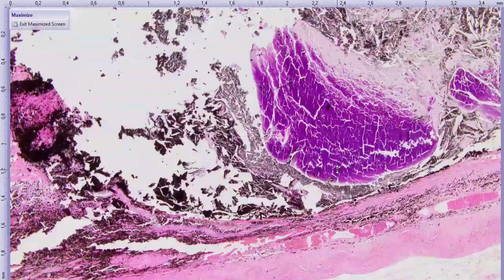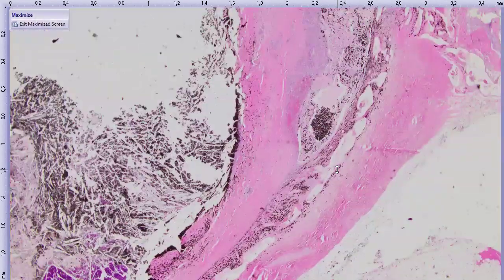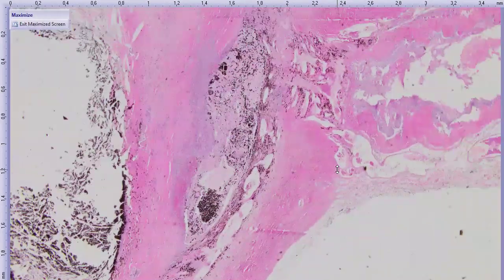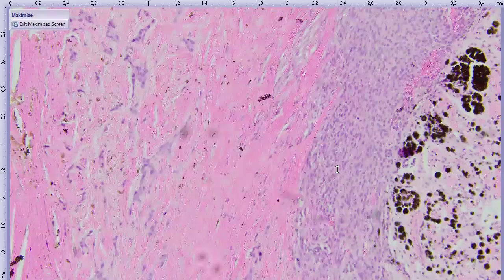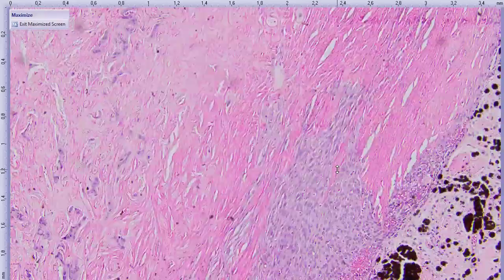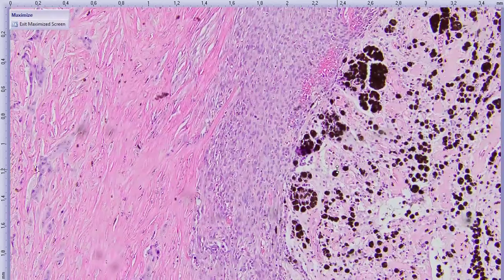Okay, then again, we were just in the anterior segment so far. We haven't even got to the back. So areas of necrosis and mineralization. There are these extensive areas of fibrosis in the back of the eye, probably related to that area of scleral rupture that we've seen before. But then you look at these cells and they don't look like they belong here either. So potentially part of the neoplasm.